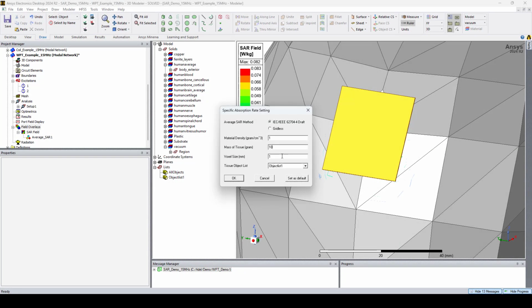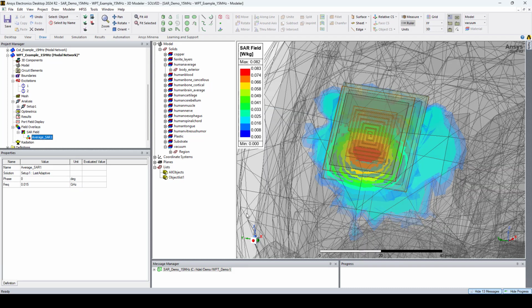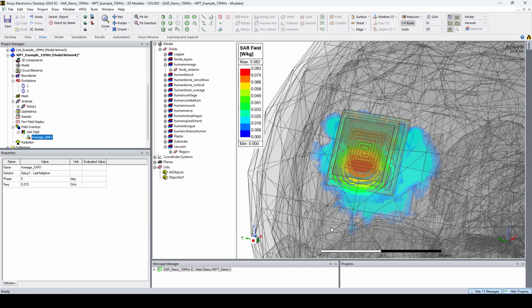Similarly, we can plot the SAR averaged over 10 grams. The simulated SAR maximum value is 0.082 watts per kilogram, which corresponds to an input power of 24.4 watts to achieve the European limit of 2 watts per kilogram.